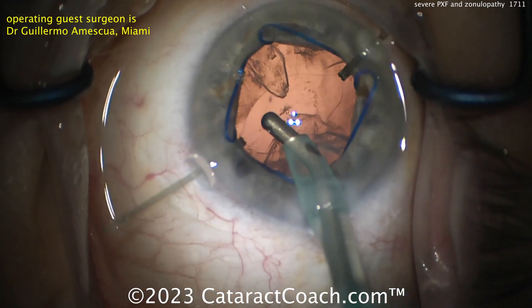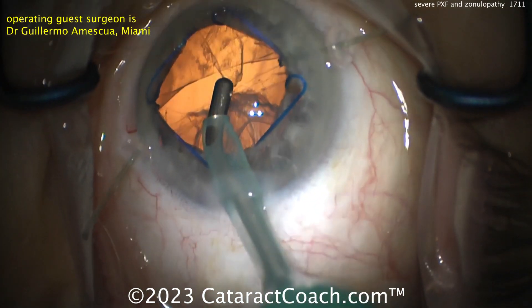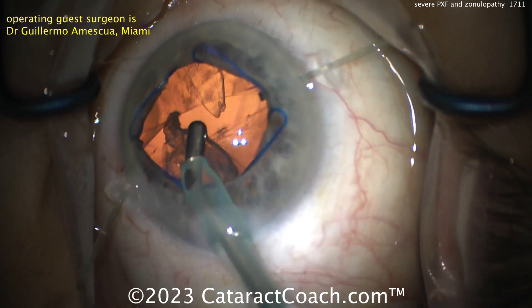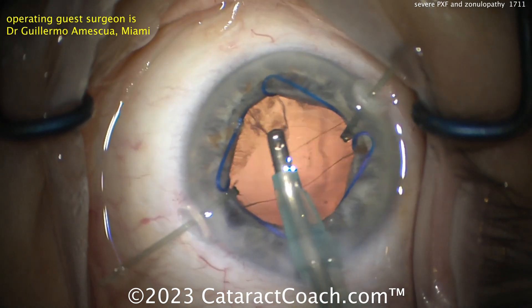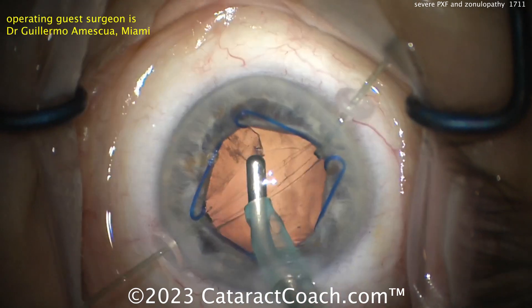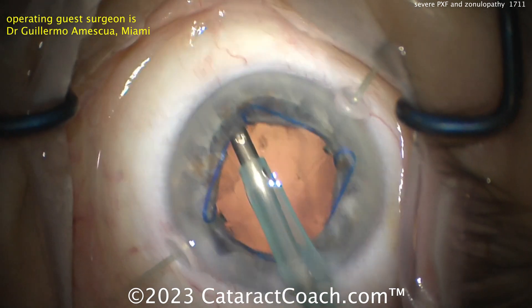Cleaning up the cortex here — look at the oval shape of the rhexis because of those two capsule hooks, and look how narrow that opening is. You've got to operate within that small opening. Coaxial works fine, but I'd probably do a bimanual approach. This is a very tricky, really stressful case for a surgeon.